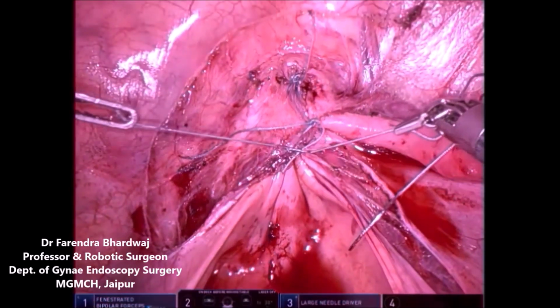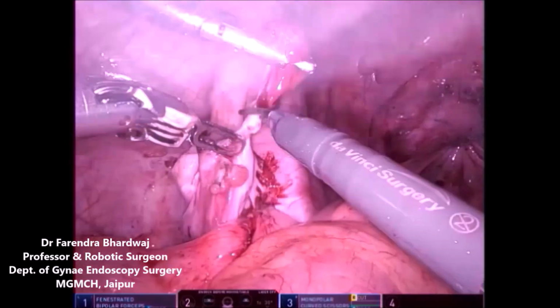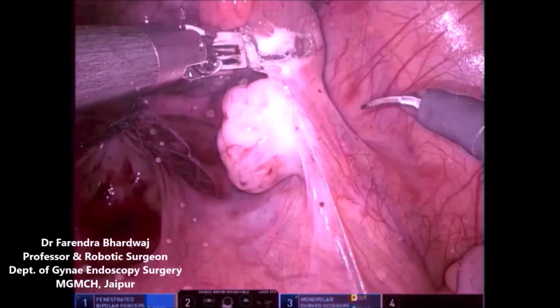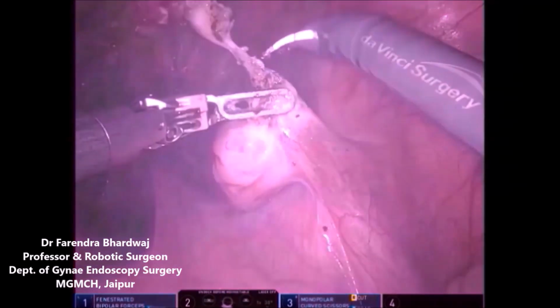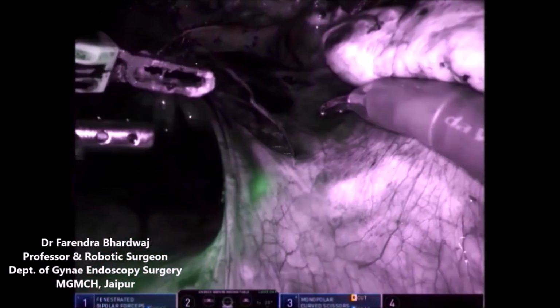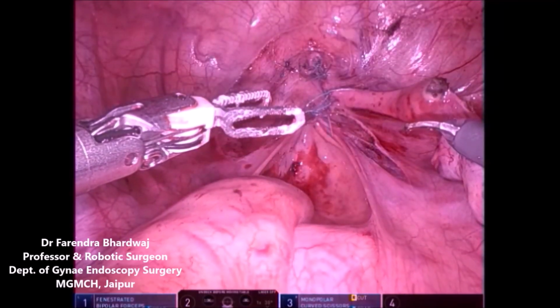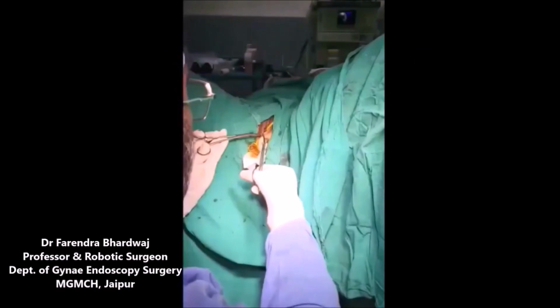Ethibond 2-0 suture is used to do the suturing. A tubal remnant is excised and removed. Integrity and the patency of the ureter was checked and thorough wash given.